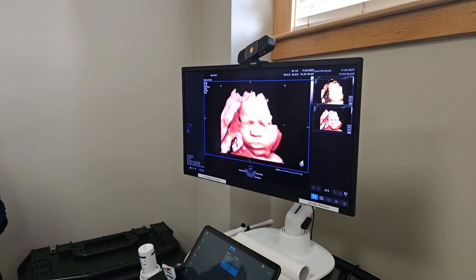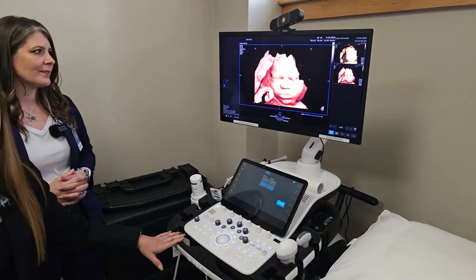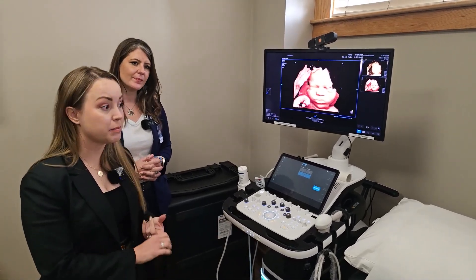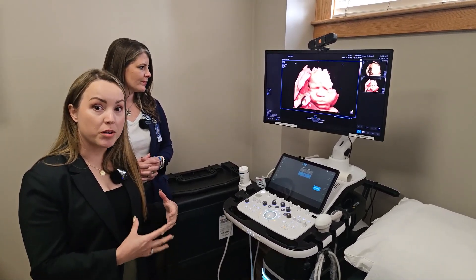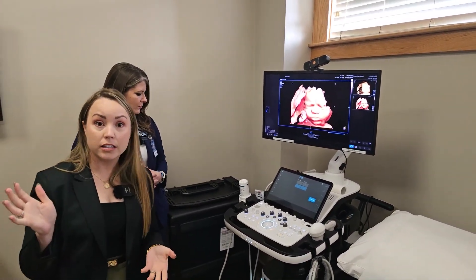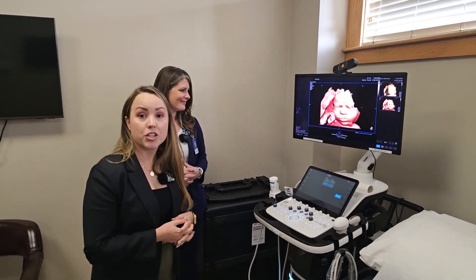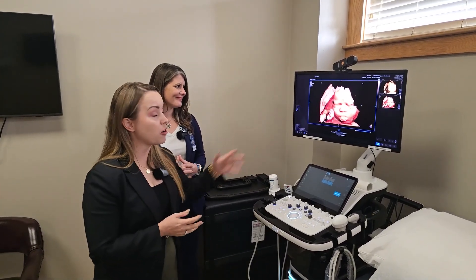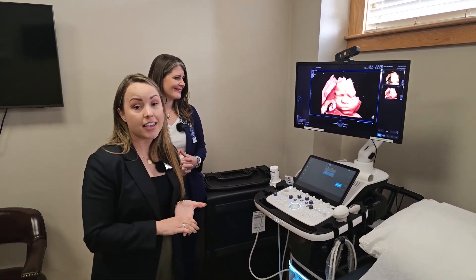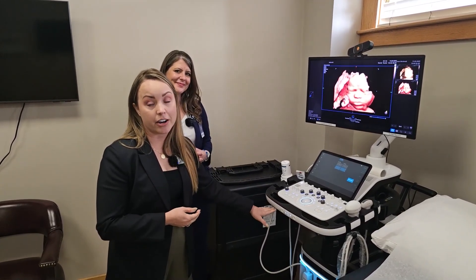This is the Hera W10 Elite Ultrasound System, which is more set up for women's health applications. It can be found in MFM — maternal fetal medicine — facilities that specialize in high-end OB-GYN exams, on hospital OB units for mothers getting exams before delivery, and in OB-GYN facilities. From before moms even get pregnant through after pregnancy, you can evaluate reproductive health right here on the Hera W10 Elite.